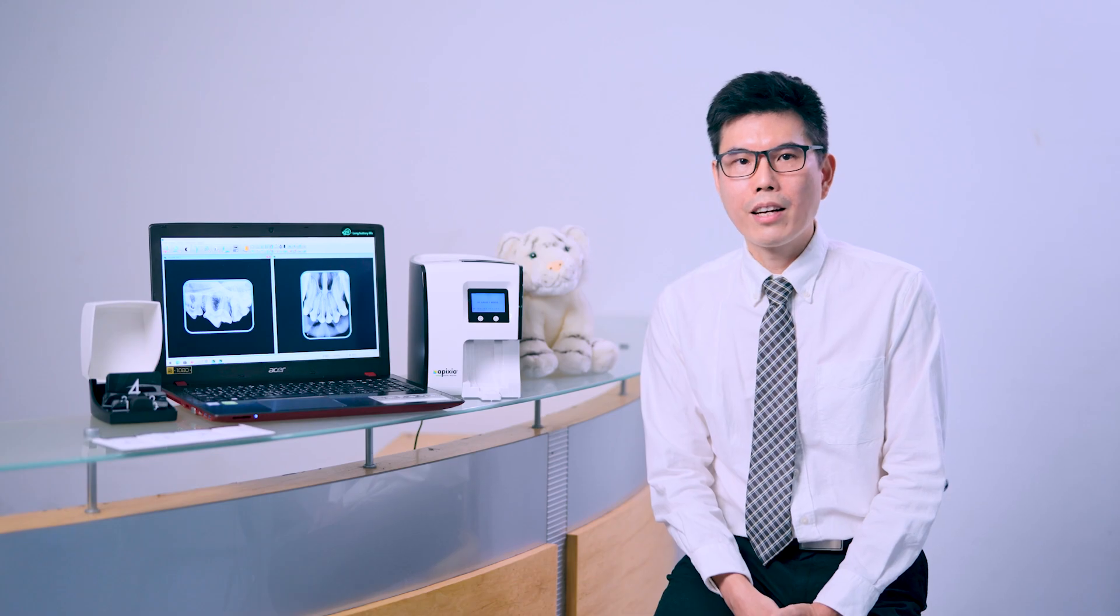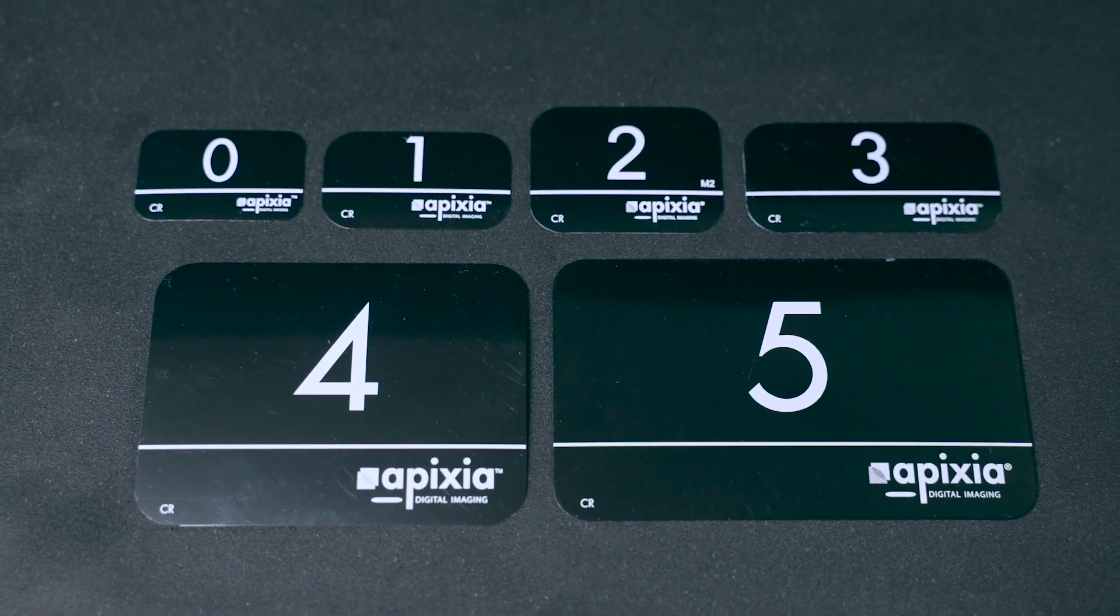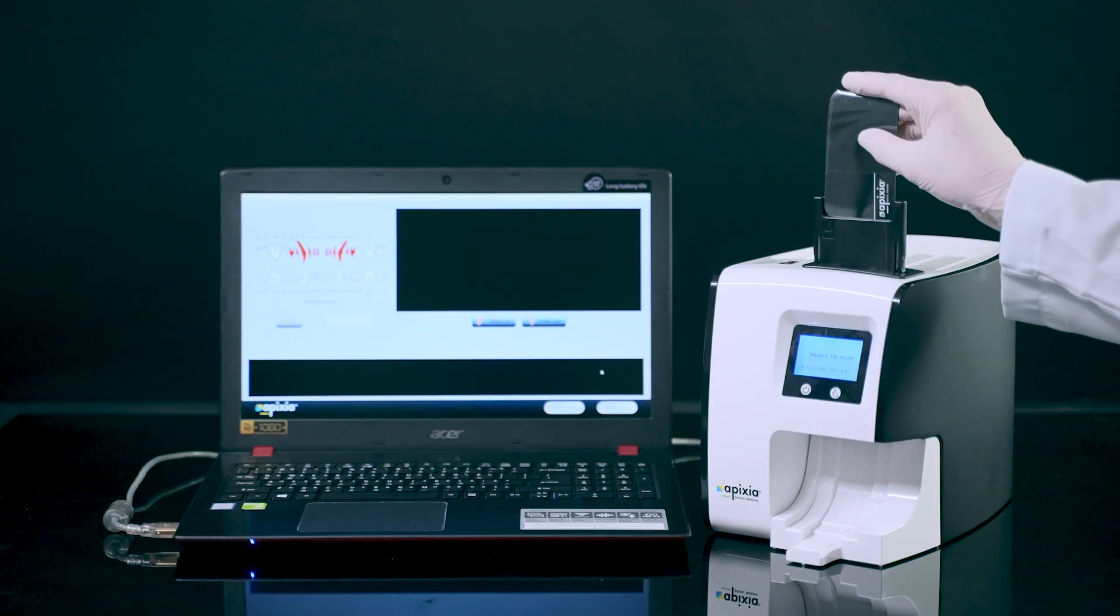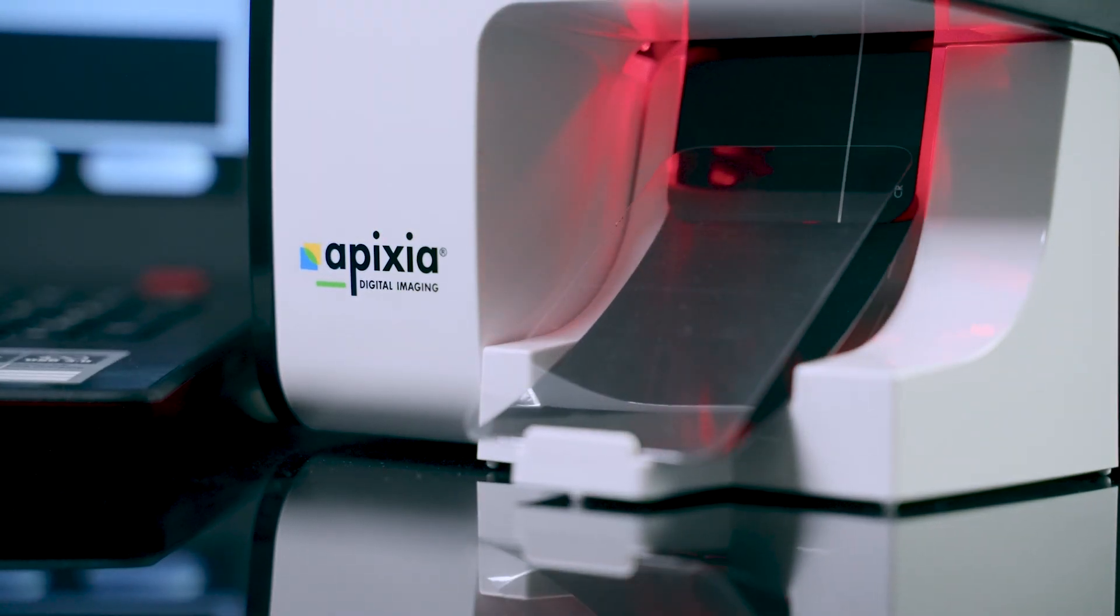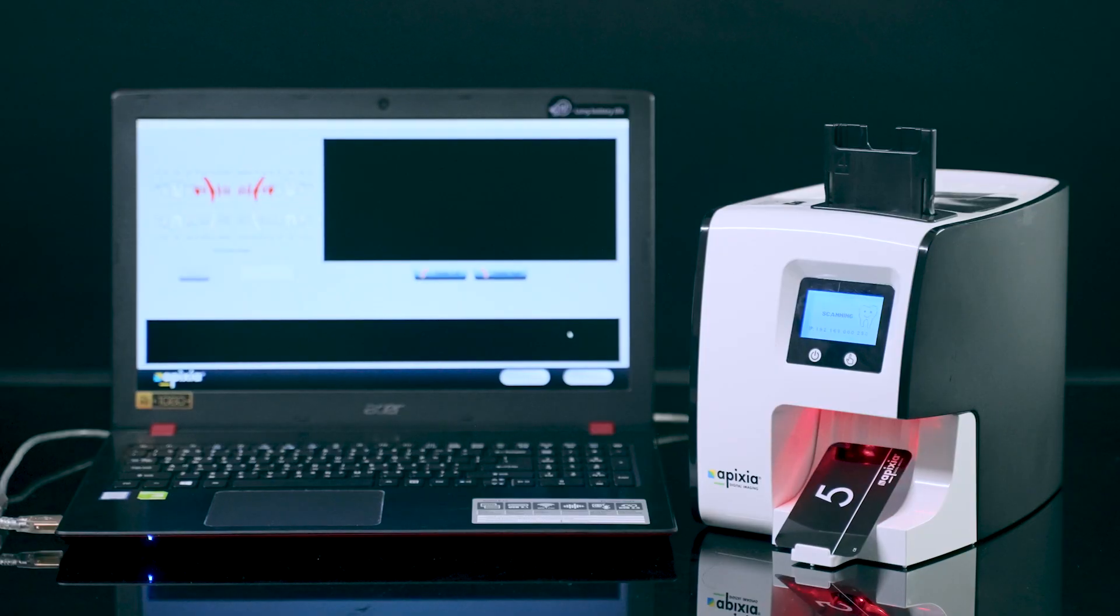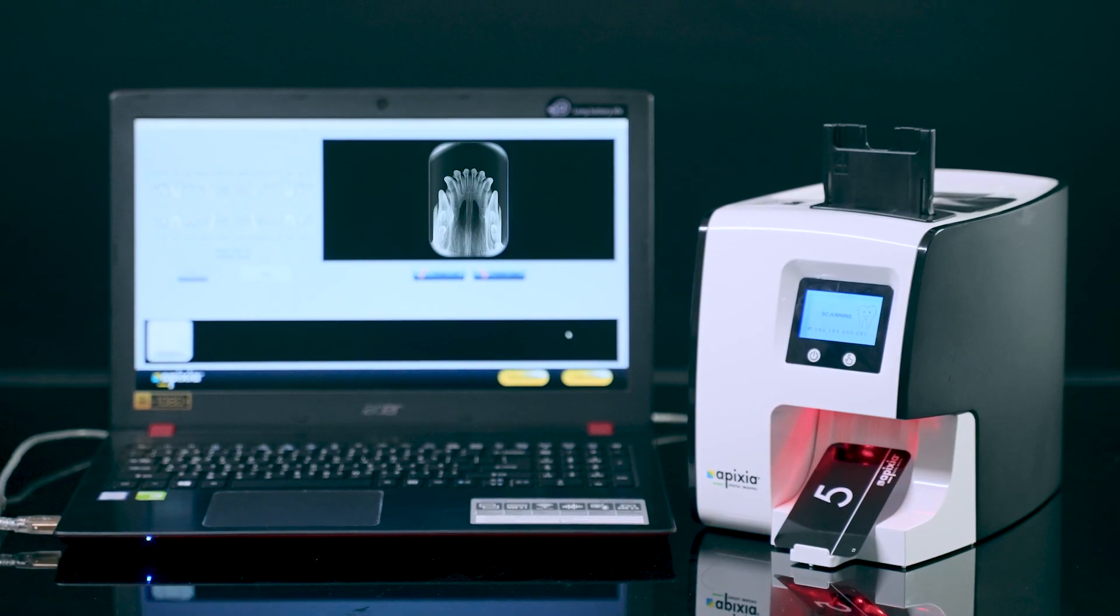We offer six sizes of plates, size 0 to size 5. You can take x-rays for the size of your choice. After the x-ray, just scan the plate in our PSP scanner. In a few seconds, you will see the crystal clear image on the computer screen.